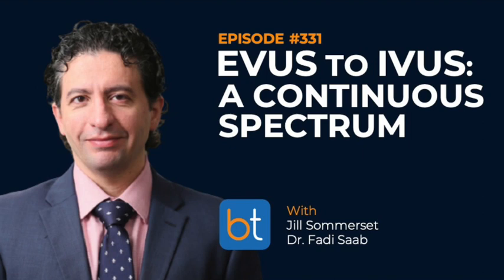Like she said, yeah, EVUS is not going to be helpful to visualize things through it, but guess what? This is a very valuable piece of information to the physician, that I'm dealing with complex anatomy and I need to change my mentality, and it's not going to be 5 minutes just in and out, right? So it really helps with the planning and organization, and quite frankly, not wasting your time attempting things that are not going to work. One of the most frustrating things for me is when people say, well, I'm just going to try, and if I don't succeed in 10 minutes, then I'm going to switch.